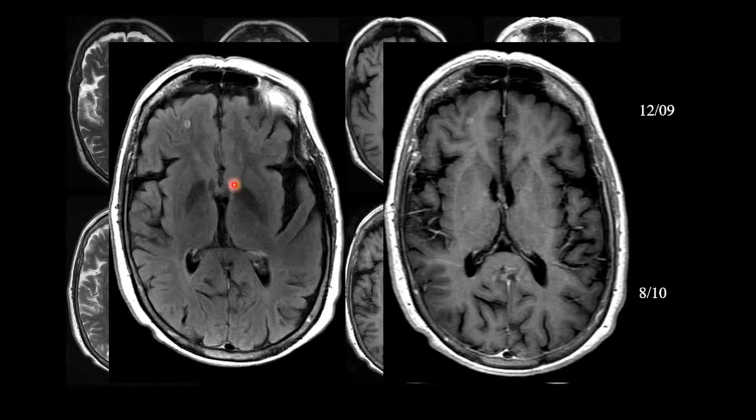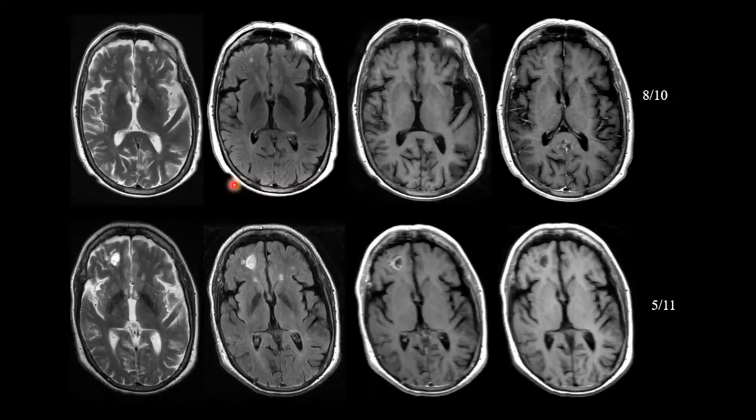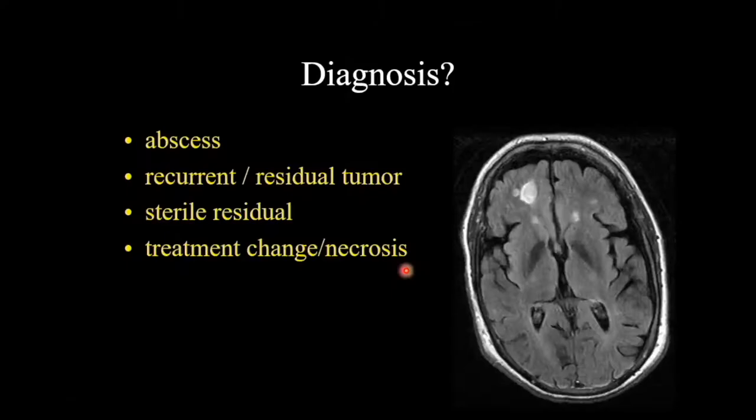We have no trouble determining this is a metastasis. The patient was treated and came back roughly six months later. Here's the initial lesion, and here's the follow-up — it's bigger, and there's a second ring-enhancing lesion. So now, what do we think? Is this an abscess related to treatment? Is it a sterile tumor residual? Is this treatment change and of no concern? Or is this an area of recurrent residual tumor?